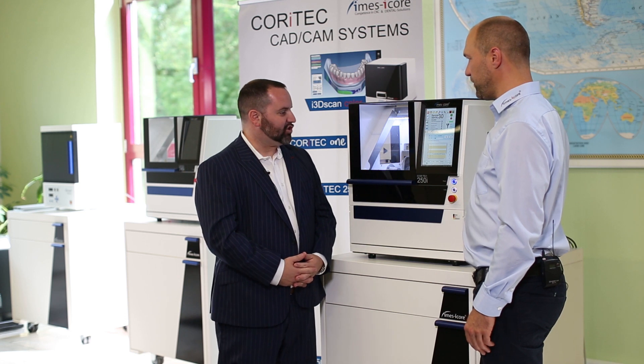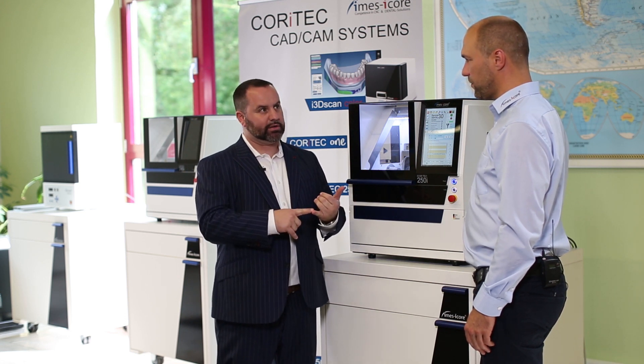So wet and dry or just dry? Exactly. You can have the machine as a 4-axis milling machine, which is a little bit cheaper, or as a 5-axis milling machine, which makes the machine more flexible — especially when you have some undercut areas to mill, or for example for bite splints, then you need a 5-axis milling machine. But for simple cases like crowns, small bridges, or glass ceramic single units, a 4-axis milling machine is enough.